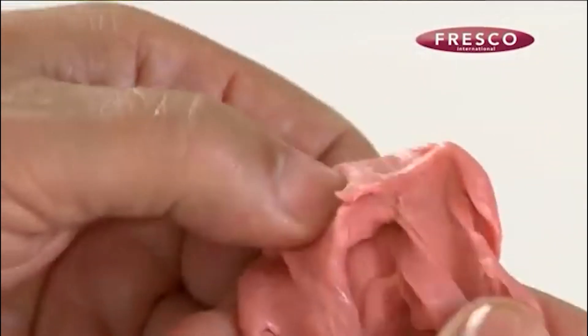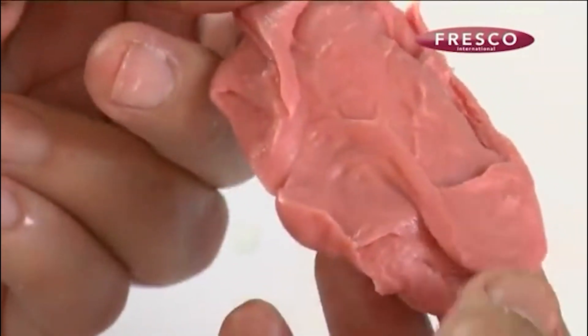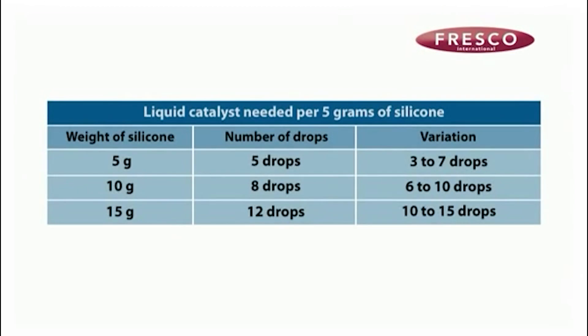Later on in this video, we will show some errors that can be made when mixing silicons. The following table shows approximate quantities of reactol needed for each weight of orthosis.